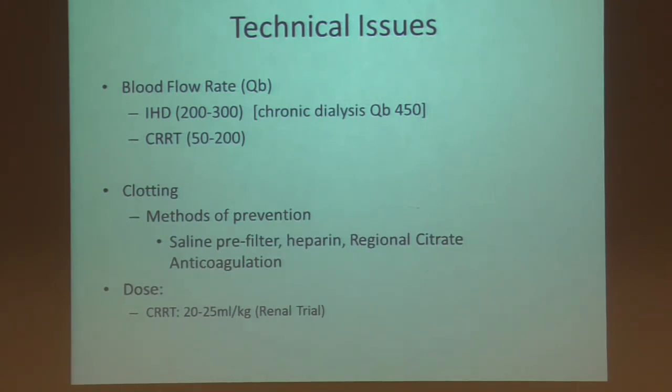So just the technical issues to see what differentiates CRRT from regular dialysis. Main thing, I think I talked about this enough, is blood flows. And I just want to touch on CRRT blood flows and clotting.